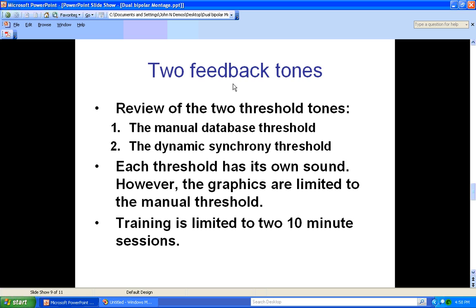Let's review the feedback tones from the two thresholds. The manual database threshold in event number one has its own unique sound. The dynamic threshold — you might call it a synchrony threshold — also has a different sound. However, graphics are limited to the manual threshold found in event number one. Training is limited to two 10-minute sessions.